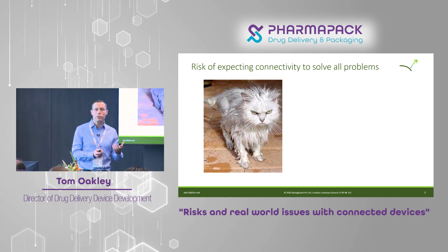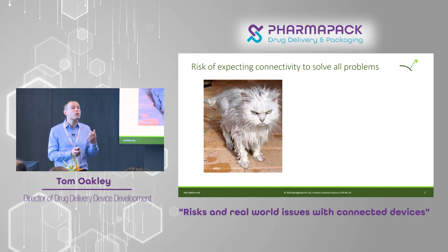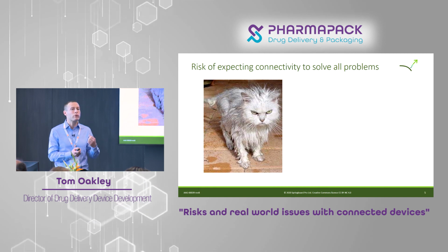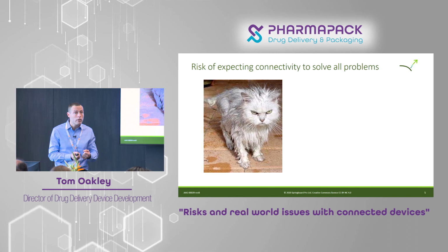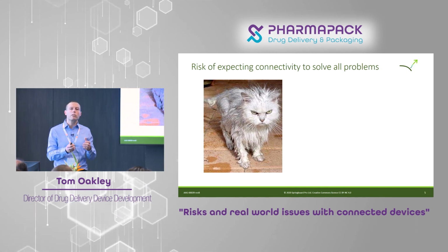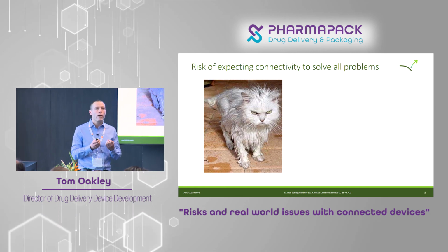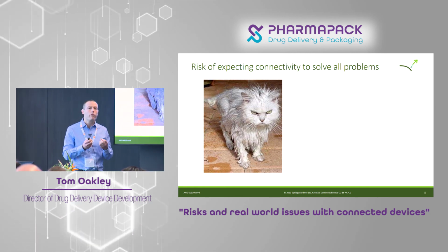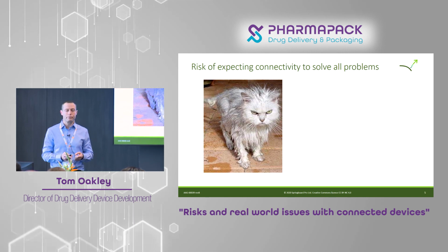So there are one or two out there that measure the flow rate at the same time. So they would recognize that she was not breathing through the inhaler, and they would have triggered some kind of alert to alert the healthcare provider or to tell her to seek training, something like that. So the reason I'm mentioning this is because this is a real-world case where you could fall into the trap of thinking that adding connectivity solved a problem when in fact it did not.